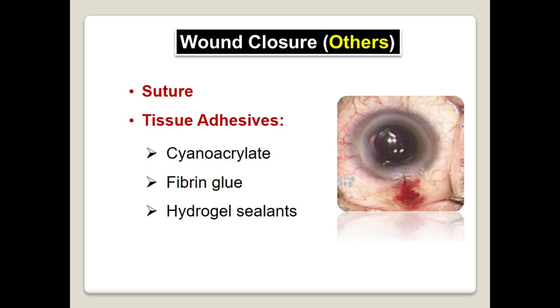In some cases, wound stromal hydration is not sufficient to secure a watertight closure. The common cause is improper wound construction. However, with proper wound construction, fluid leak may still continue in certain cases such as trichia, corneal scars, and in elderly patients. If the wound is unstable, do not hesitate to take a suture — a suture is not a shame.